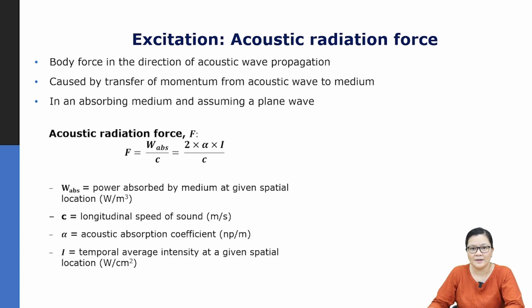In an absorbing medium, assuming plane wave propagation, meaning longitudinal wave propagation, the acoustic radiation force F equals the power absorbed by the medium at a given spatial location divided by the longitudinal sound speed C. That equals 2 times the acoustic absorption coefficient of the tissue times the temporal average intensity at a given spatial location in the tissue.